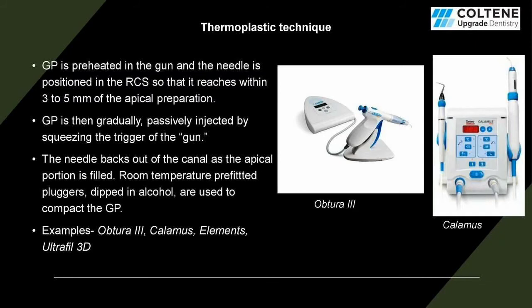Now we have the thermoplastic technique. It is basically the backfill that we do with GP pellets, or basically plasticized gutta percha. And instruments like Obtura 3, Calamus, Elements, all these instruments are used. Let me remind you that these instruments are significantly costly.